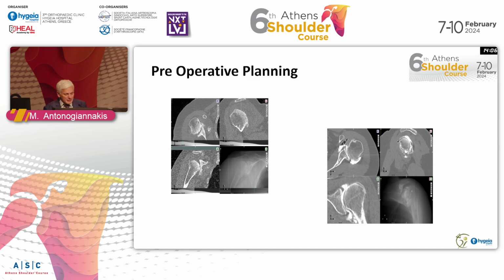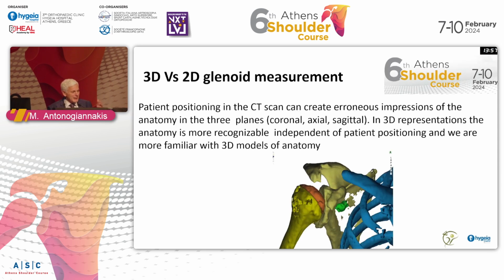And then we had the CT scans. But these two-dimensional images were quite not understandable. And then came light, all these softwares that could transform the two-dimensional images into three-dimensional images, and then we could have the scapula, and then we could have the implants, and then we could start planning. Oh, perfect.